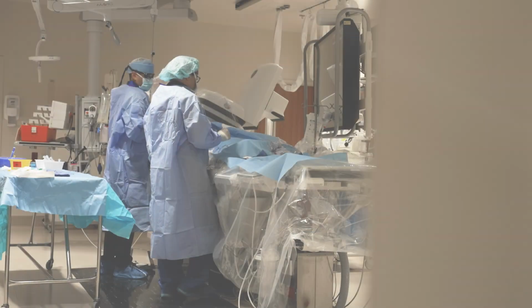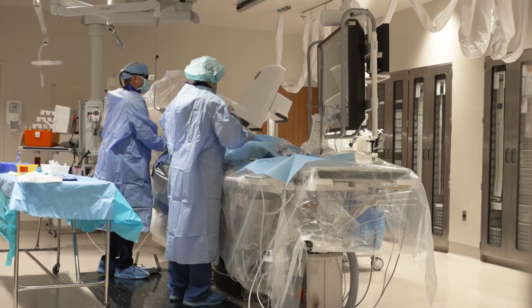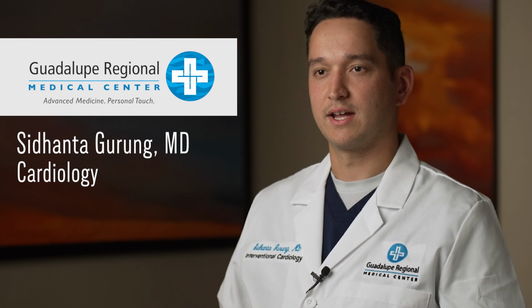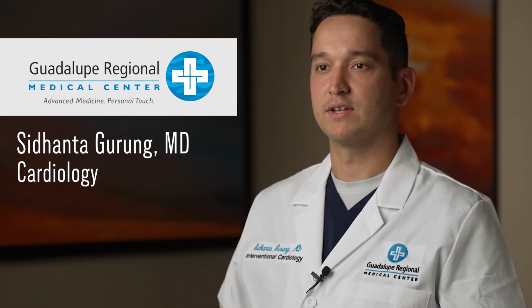So the Catheterization Lab is a procedure room in the hospital where we perform cardiovascular procedures. We use X-ray fluoroscopy to get high-definition images of the blood vessels of the heart and of the peripheral vasculature to help us diagnose coronary artery disease and perform interventions if needed. Coronary angiogram is the gold standard for diagnosing coronary artery disease.